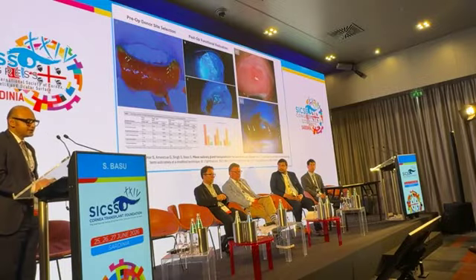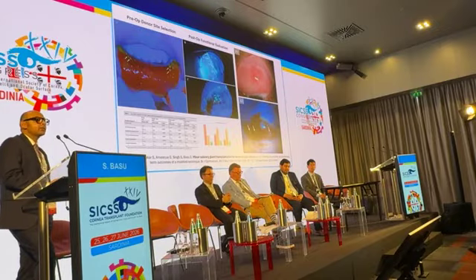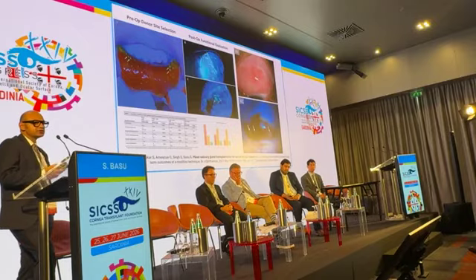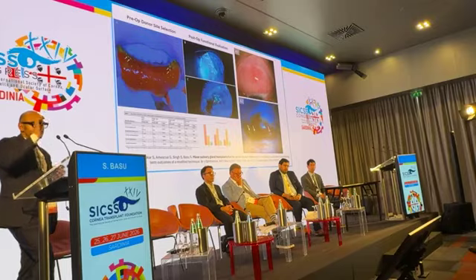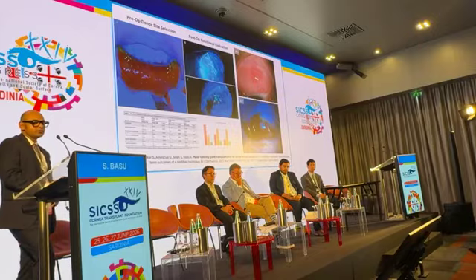What's very interesting is that you can use fluorescein to first of all check in the lips what is the ideal site for harvesting these glands. So you can check preoperatively and see which are the glands that are functional and more likely to work, and take your biopsy or your donor glands from there. And also post-operatively, once the gland has reperfused, you can just use a fluorescein strip and, like a Seidel's test, just paint the glands with the fluorescein and actually see the secretions to check if your transplanted salivary glands are working.